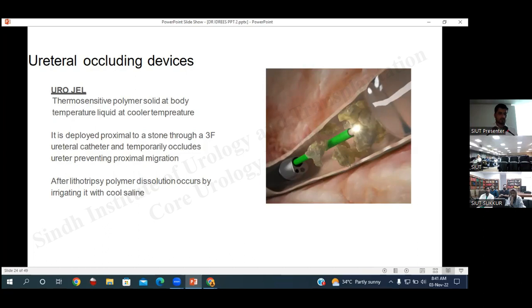It was from Dr. Hamad Athar. So I think it is something very cost effective. Everybody should do it rather than retropulse the stone and then subject the same stone to lithotripsy. That is rather odd because you are combining two procedures for one thing. And if you are working in an environment where everything is calculated according to cost, then the cost would become double. You are doing two procedures for one stone. That is not on.